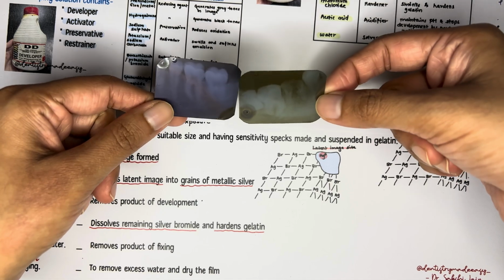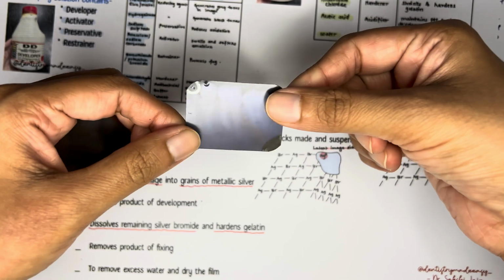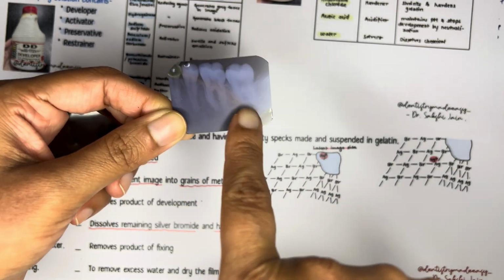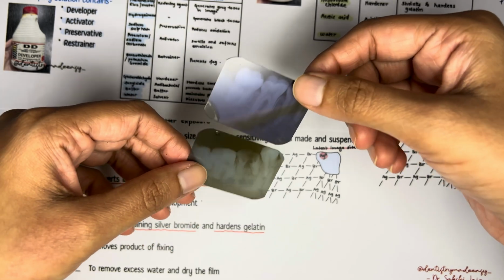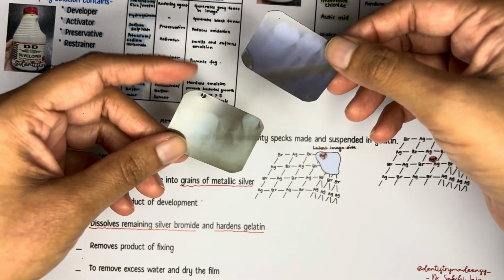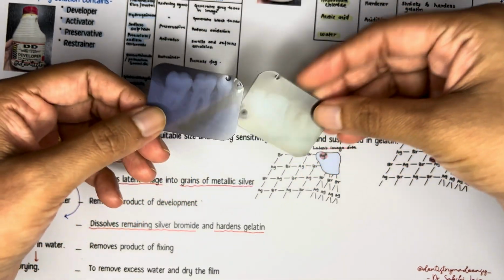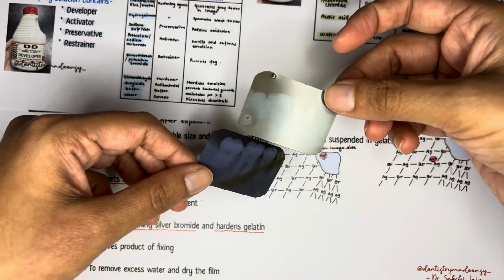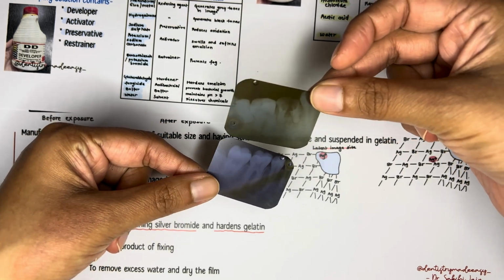In this one also there's a big line of stain present. We are going to discuss each and every error, each and every faulty radiograph through these IOPAs only. I have a big set of IOPAs with all the errors, so that you can see how exactly it looks like. Now over here also you can appreciate the difference.